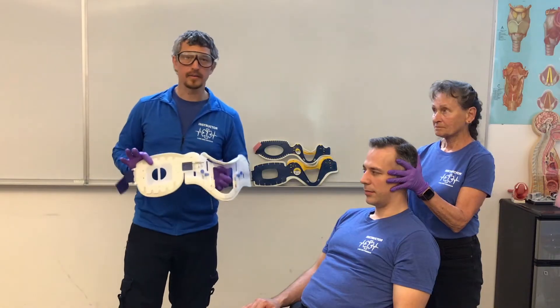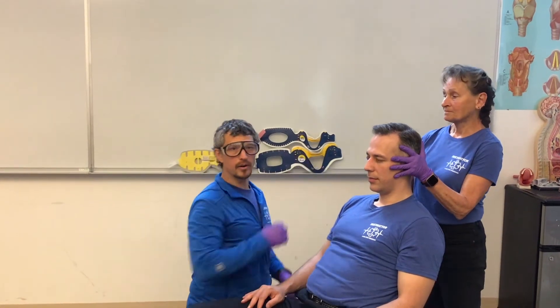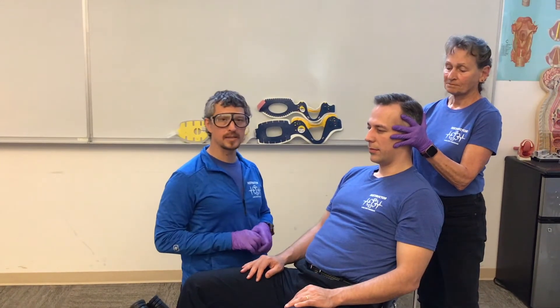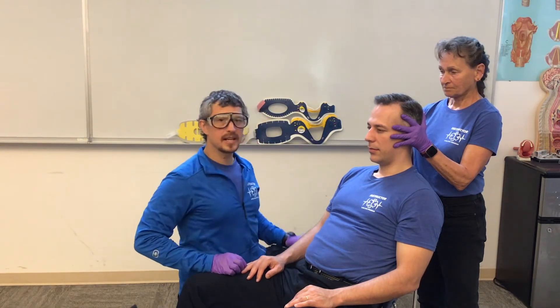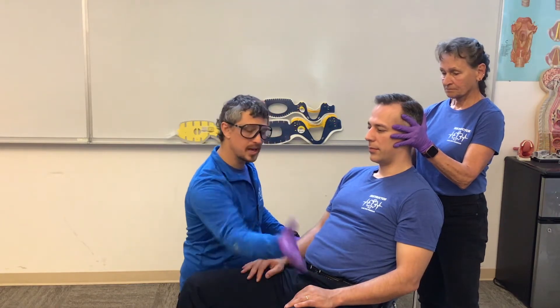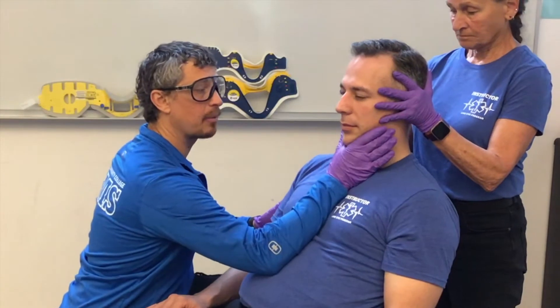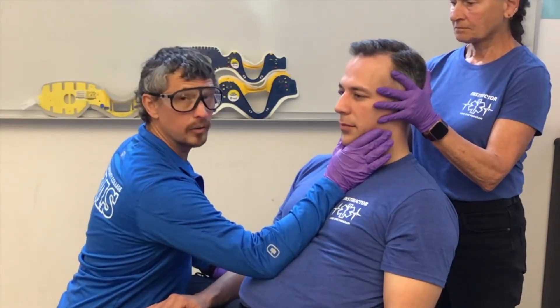First, we're going to need to direct our partner Sue to hold Nathan's head in a neutral inline position. We'll go over more neutral inline position in our supine spine skill. Once Sue has Nathan in a neutral inline position and secure, I'm going to take my forearm, press it against Nathan's sternum, and help hold his chin with my hand.